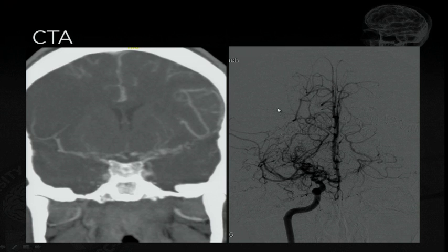You see this puff of smoke pattern, which is the moyamoya pattern. The patient would present like a stroke, like an LVO, maybe even severe. But if you notice this, then you should call it moyamoya. Okay?